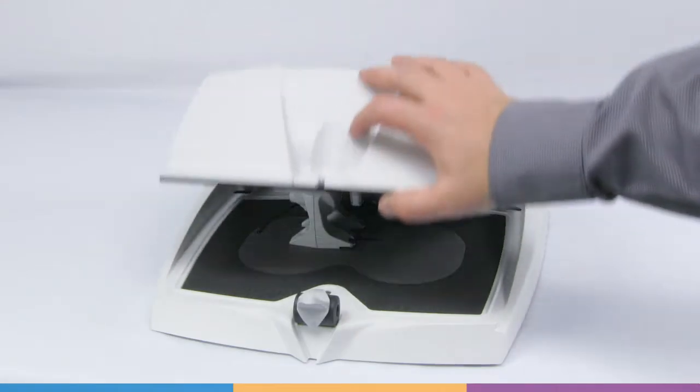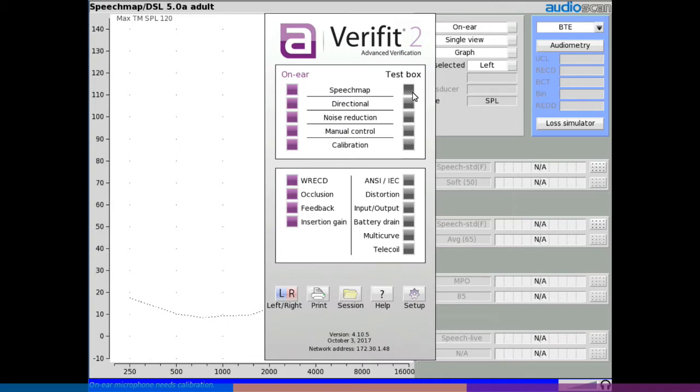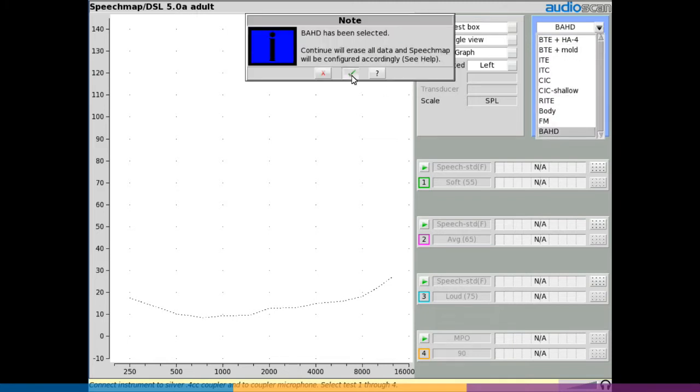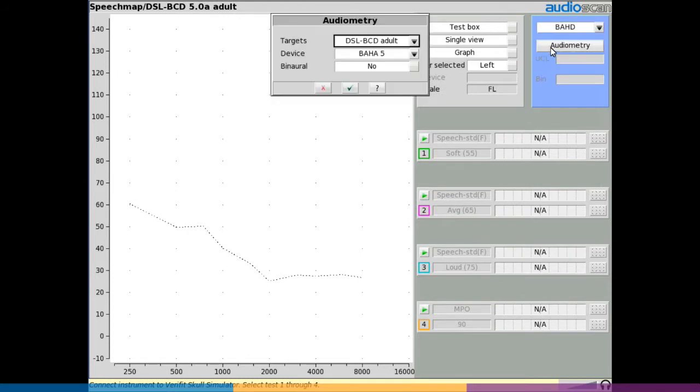Close the test box lid and proceed to your desired test screen. For speech map verification, right-click to open the main test menu and select speech map from the test box tests. From the instrument drop-down list, select BAHD. Select the green check to continue, then select audiometry on the speech map screen.